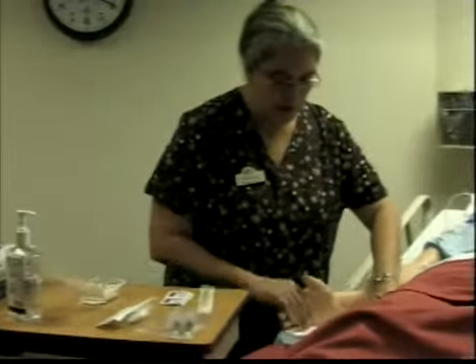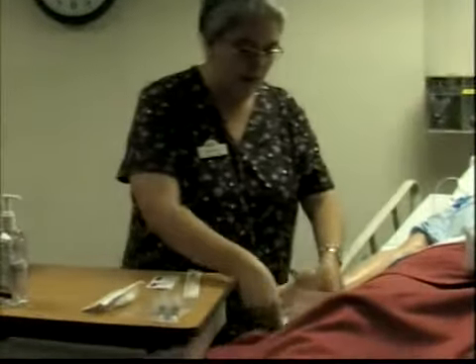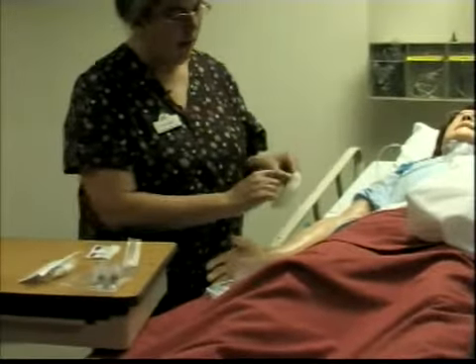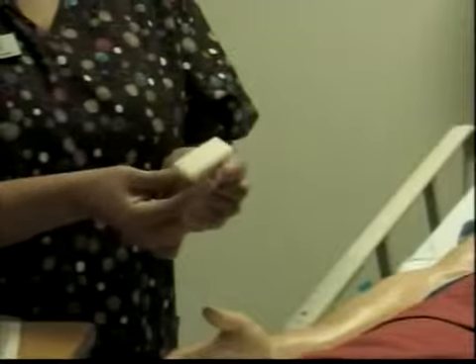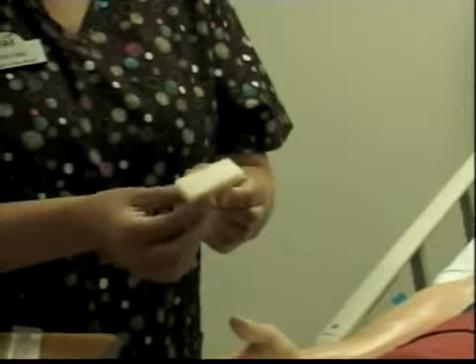I will put everything on the patient's bed right on top of the blue chux, so you have it available. This is your Tegaderm, and the Tegaderm has a little part where you put your date, your time, and your initials, and you peel that off and put it on the side, and I'll show you that in a minute. It has the supply that they will give you to clean. Before, we used alcohol pads; now we actually have something that is less irritating to the skin, and it is only one, so you'll be using a circular motion, and you'll see that when I perform it. You have extra gauzes in here.